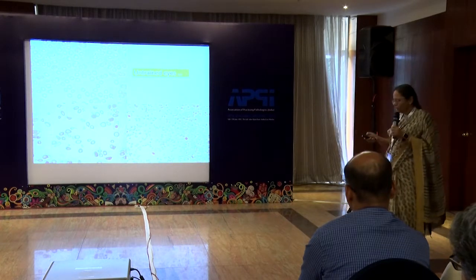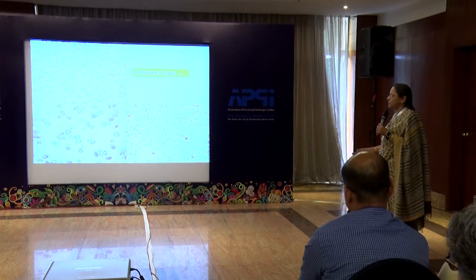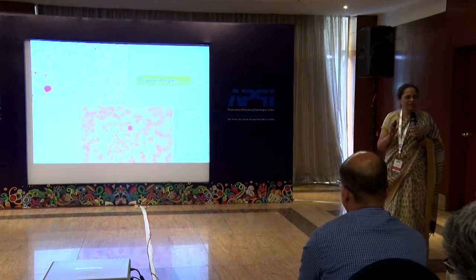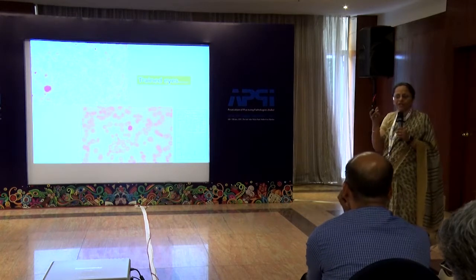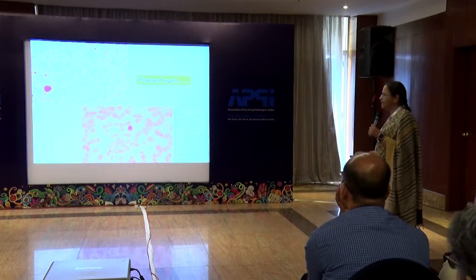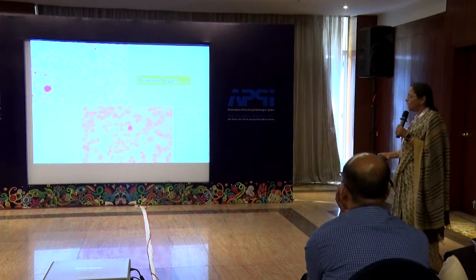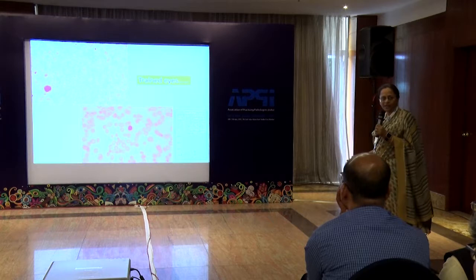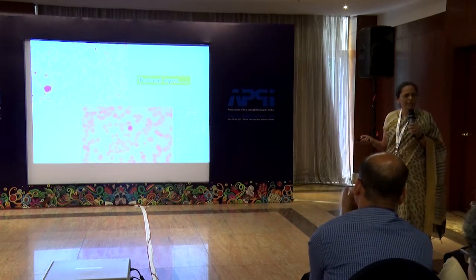When you joined though, I'm sure you couldn't make out that this field was very different from this field. To an untrained eye, there isn't much of a difference. But as somebody puts effort and trains you, you start to learn and you start to build a virtual visual library. Each one of us has such a rich library in our visual cortex. Look at this and look at this. For an untrained eye, they won't be very different. But to a trained eye, I would say, please go ahead and do a serum ferritin and confirm. To this, I would say, please do an HPLC. So once you train, you pick up something so crucial, so intrinsically different.